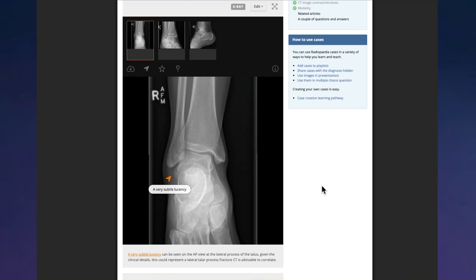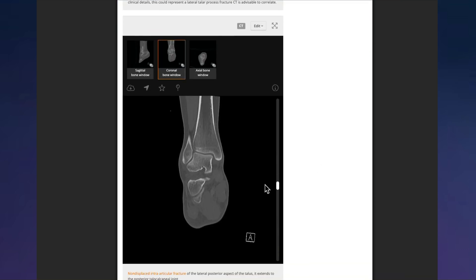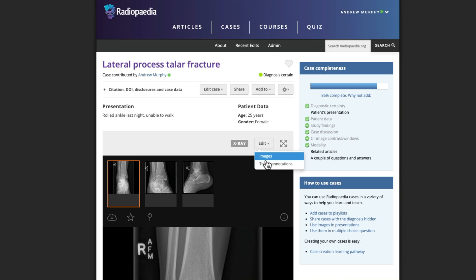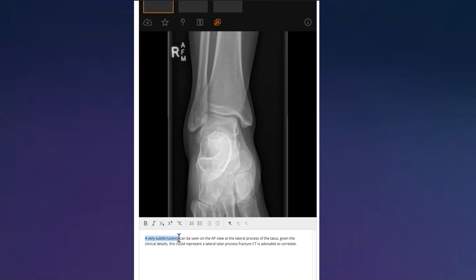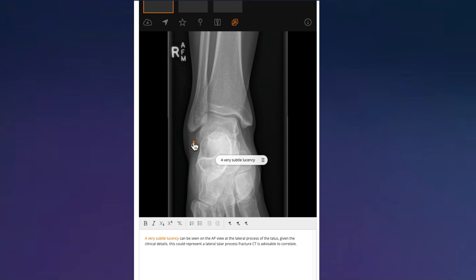Annotating your Radiopedia cases like this is easy. Let's see how. Go to your case and click on Edit Text and Annotations. Highlight the finding you want to annotate, then click on the Annotate button and move the arrow to your finding.